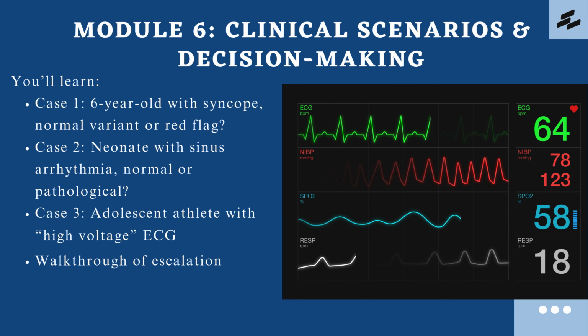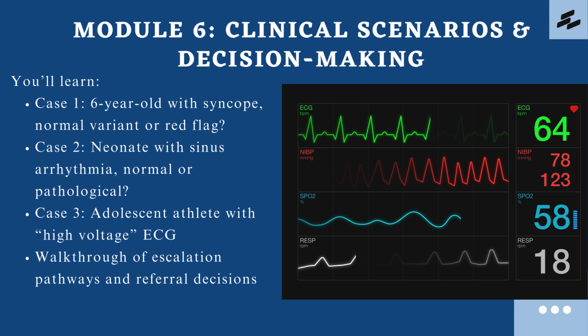Module 6: Clinical Scenarios and Decision-Making. This module applies your learning to real-life clinical scenarios. In the first case, we look at a 6-year-old presenting with syncope. Was the ECG finding a normal variant or a red flag? In the second case, we review a neonate with sinus arrhythmia and consider whether this is normal or requires further investigation.